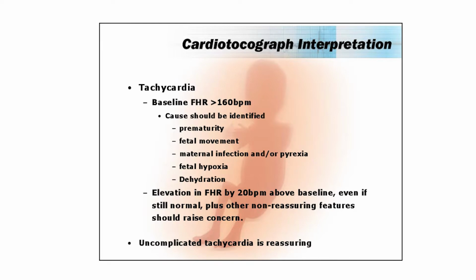And one of the hardest decisions that I think is to be made is, what happens if you have a grossly abnormal 28-week CTG? What do you do? Because no matter how good we think we are in maternity care, you know that in that situation, we really have just one of two decisions to make.